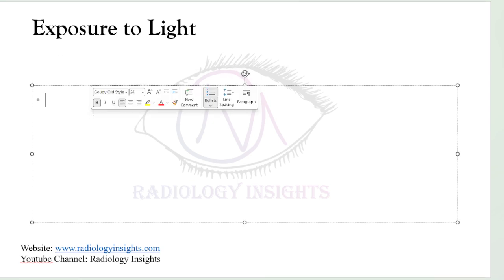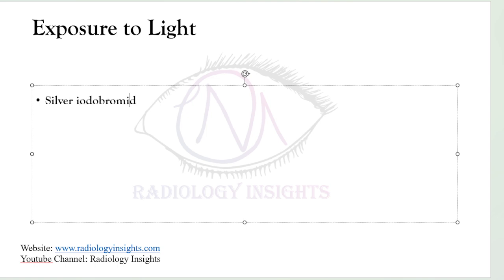The silver iodobromide crystals are present on both sides of the film, and these crystals are important. There are two features of silver iodobromide crystals which account for photographic processes. One is the small proportion of iodine relative to bromide ions.